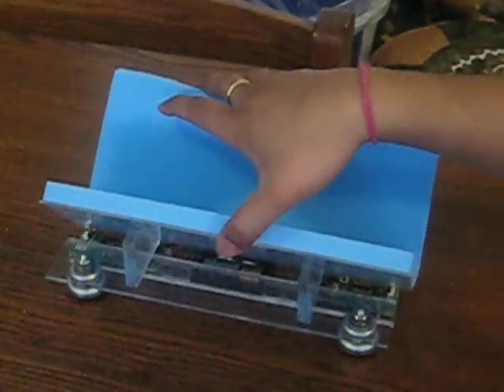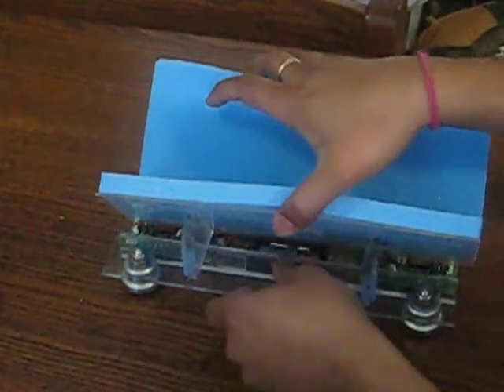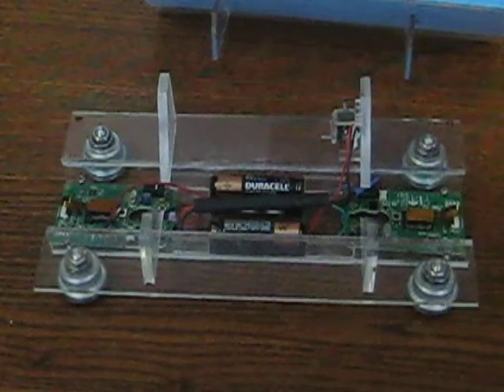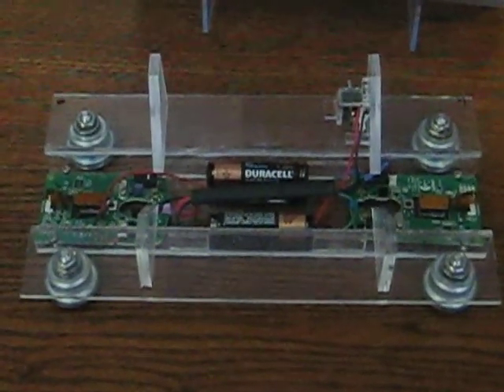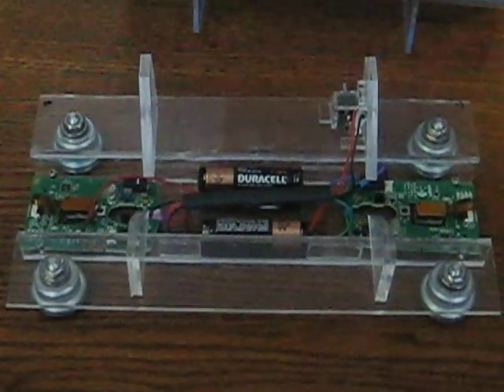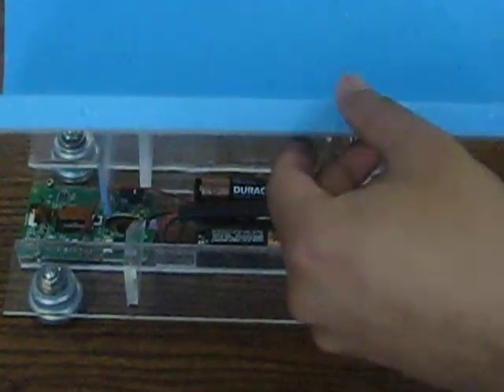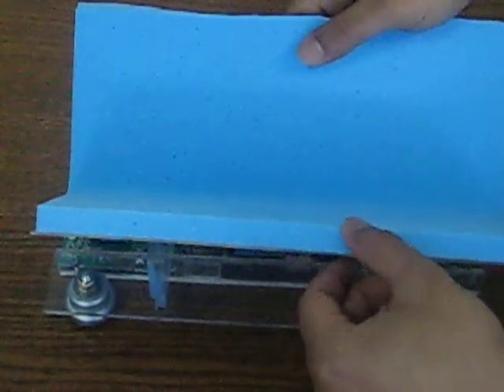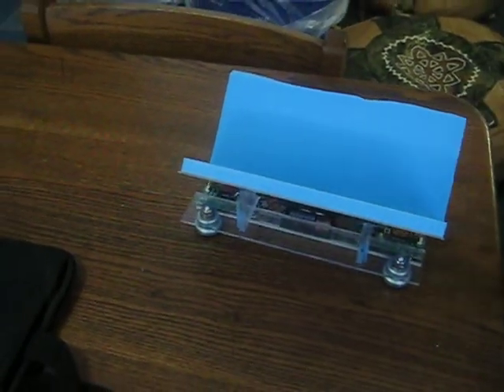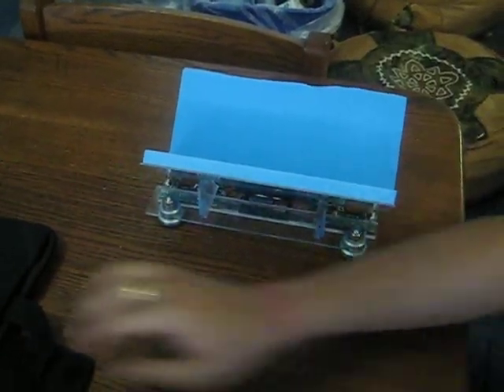And in order to do this, we use 2 laser mice as shown underneath our device. These are the 2 laser mice. We got lucky and we were able to keep them as wireless mice, so they transfer wirelessly via USB and are read in LabVIEW. So these 2 mice will keep track of the motion of the device, and we need 2 in order to keep track of the orientation. That's basically what our device does, and it reads in through LabVIEW.